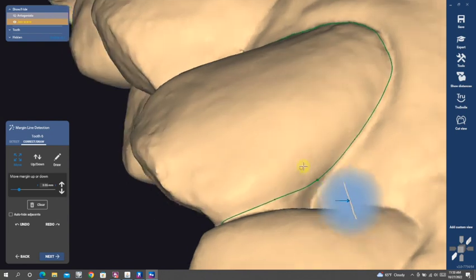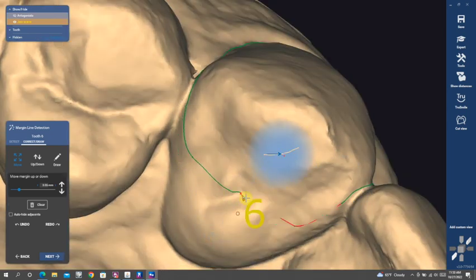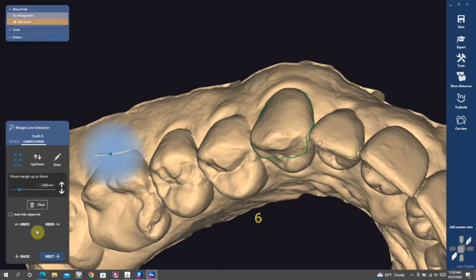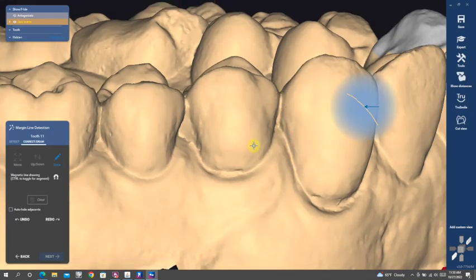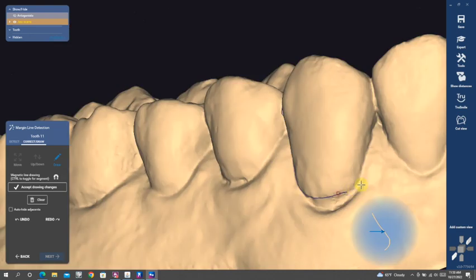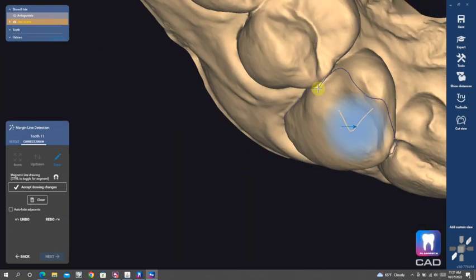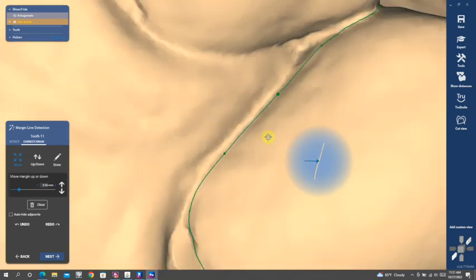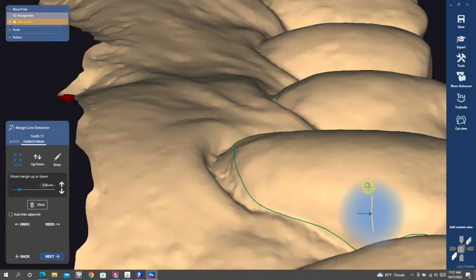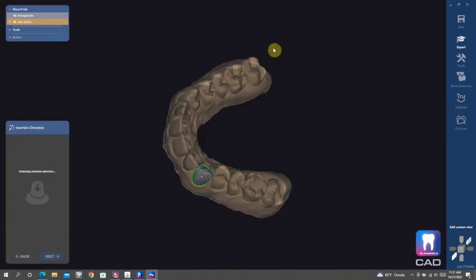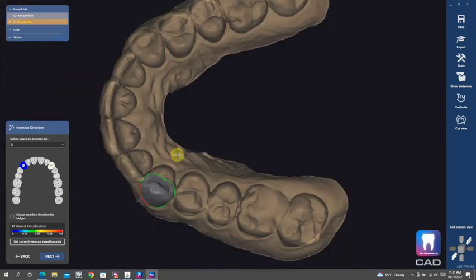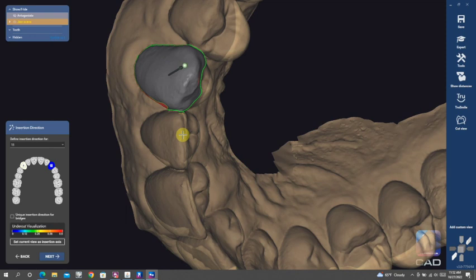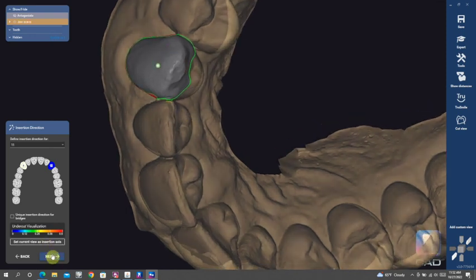What I found is that will give you actually a little bit of suction that will allow these to stay on pretty easily. Obviously, these are not going to be permanently cemented. We don't want to keep these on for very long. So if we can get a little inherent retention to them, we can put them on with like a temp bond clear or something just to wear them on Halloween. Then we can take them off and do whatever we want with them. So marking those margins is a good idea just to tuck it into the embrasure a little bit just to get some retention.